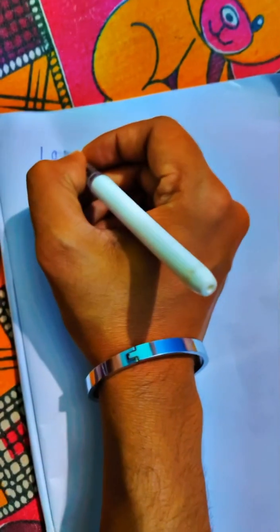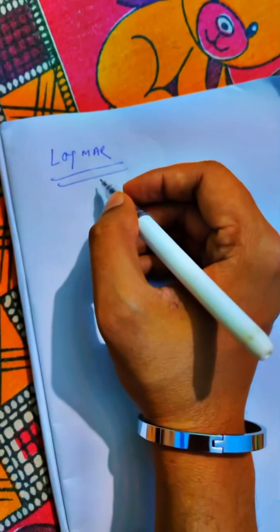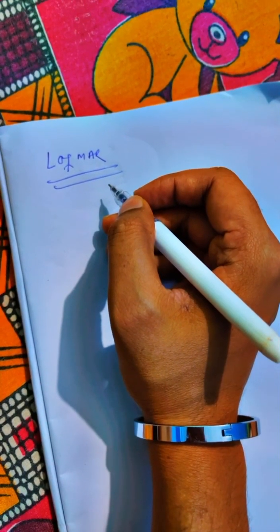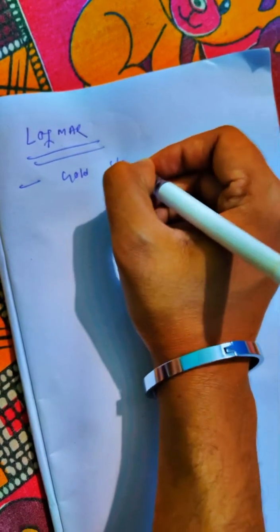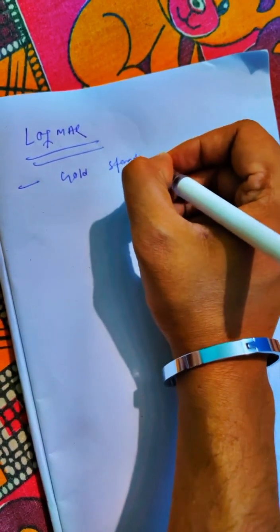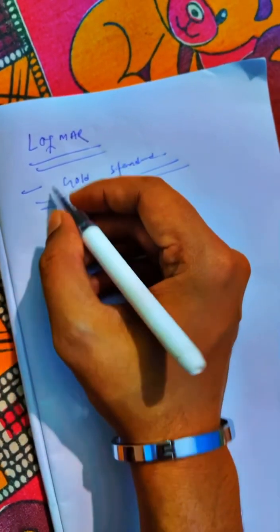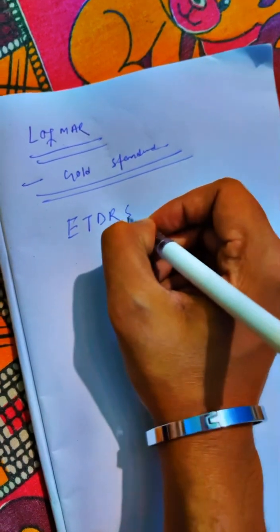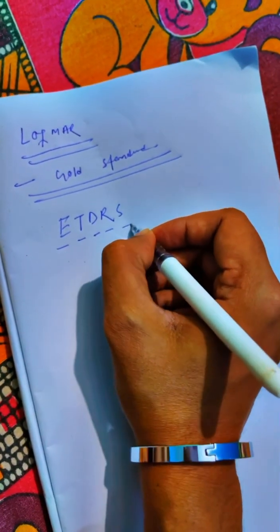Friends, today we will discuss LogMAR calculation. So why LogMAR? LogMAR gives the most accurate visual acuity among the visual acuity charts we have, and this is the gold standard visual acuity chart. The other name of LogMAR is ETDRS, Early Treatment Diabetic Retinopathy Study.